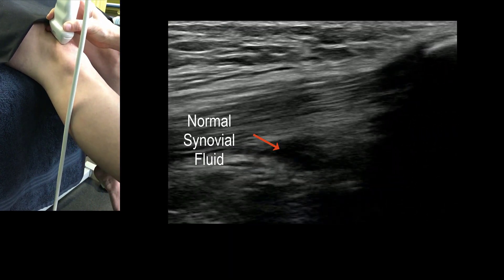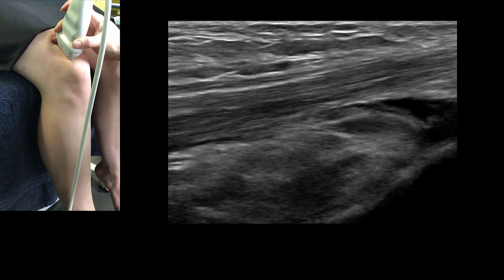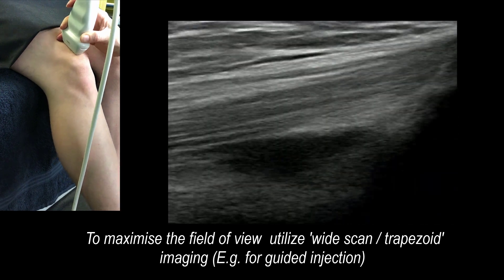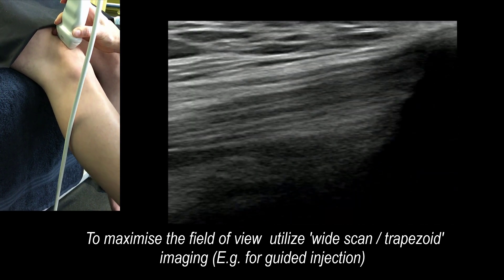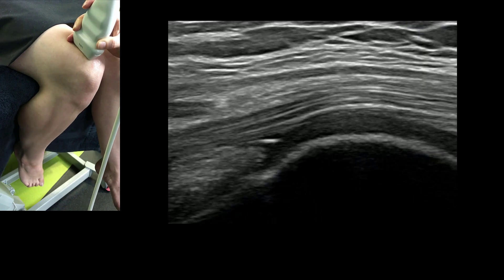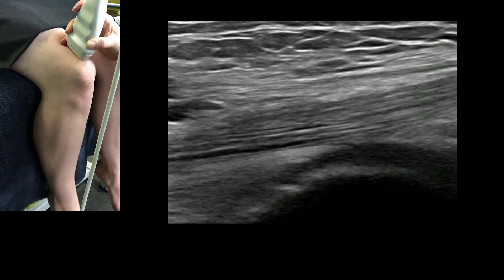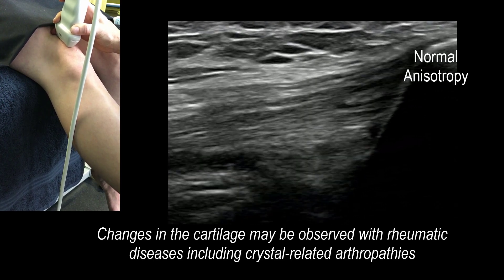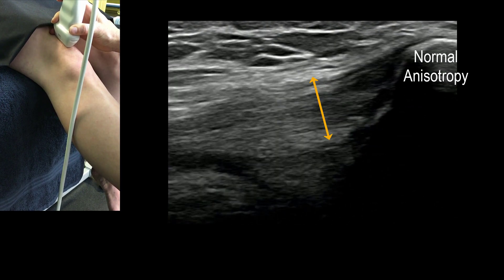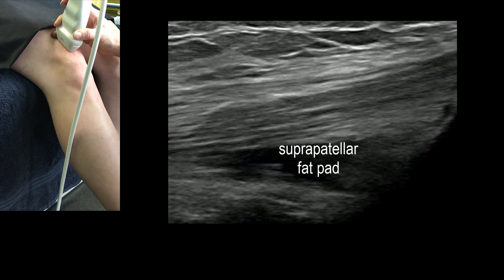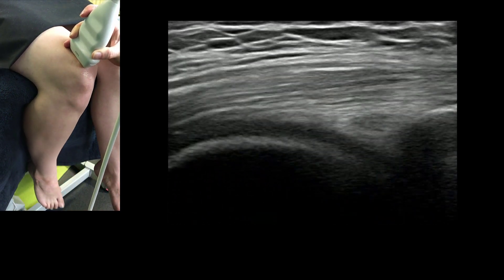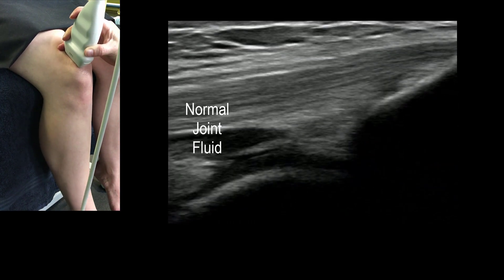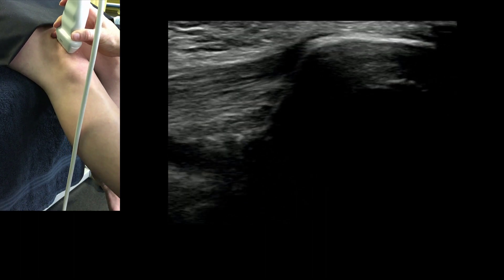You can see the fluid squelching out. Quite often it's helpful to trapezoid or wide scan, and on a larger knee we might need a 12-5 probe. You can see the cartilage of the femur as it extends back out. There's a white, black, white, black, white pattern in the tendon because you've got all four quadriceps muscles coming down and inserting into that one tendon.